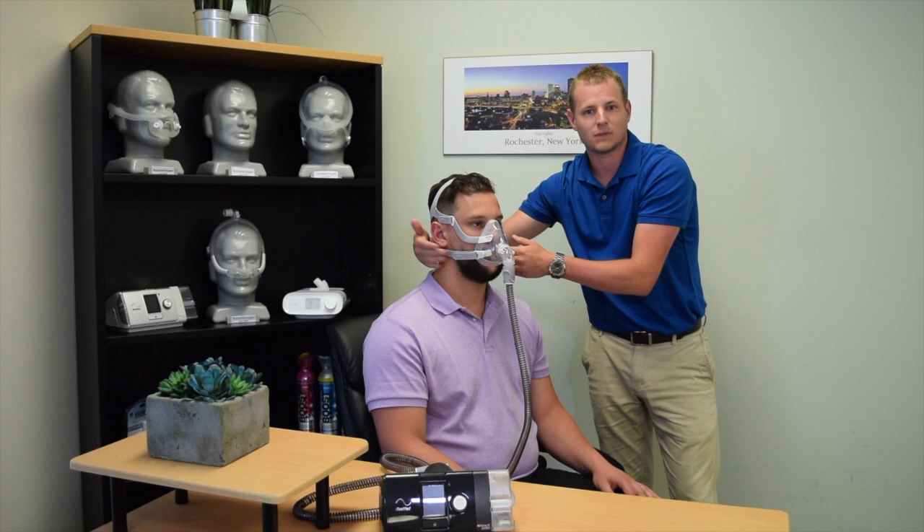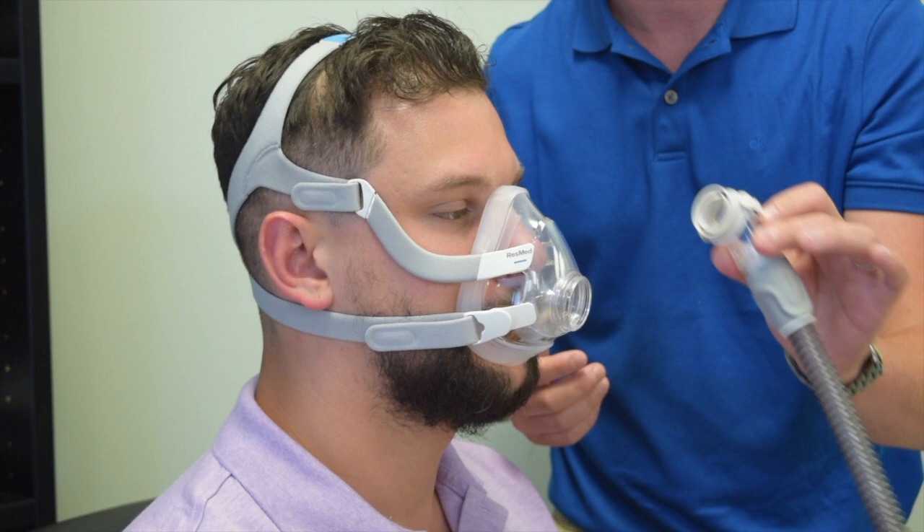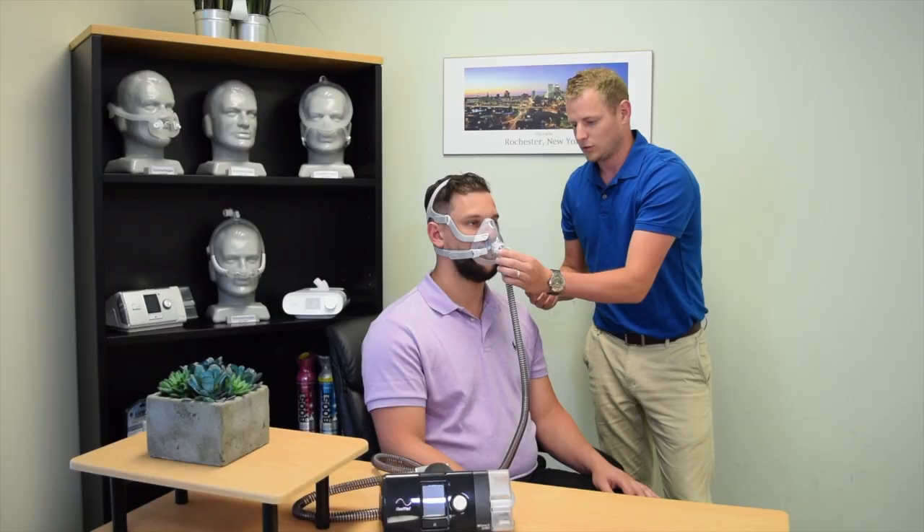The majority of masks do come with a quick disconnect that can be removed for easy access for the bathroom. Once back in place, you can resume there.